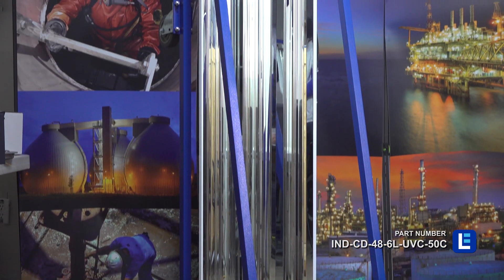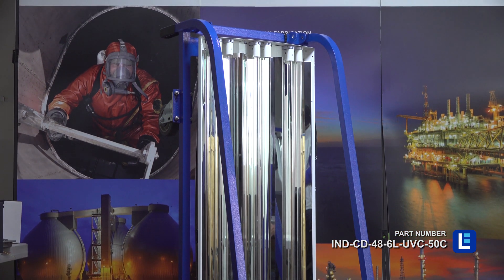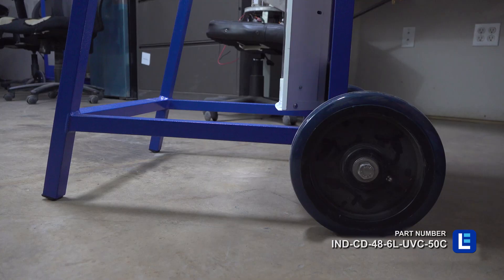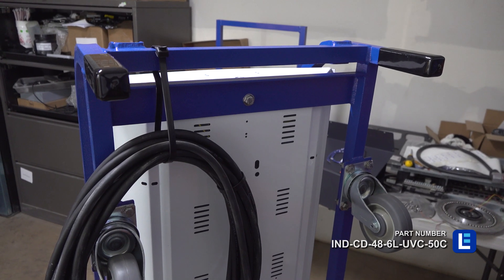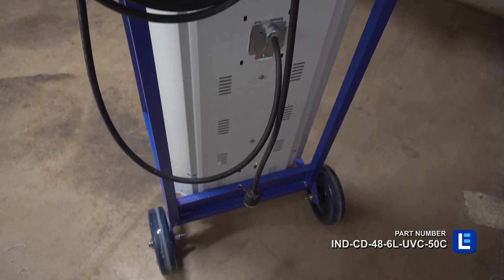This UV light can disinfect over 99 percent of bacteria, viruses, mold, and spores. The lights are mounted to an aluminum powder coated cart for seamless mobility. This UV sanitation cart is a powerful sanitation solution for industrial sites and commercial facilities.